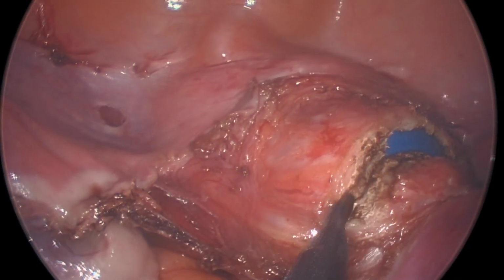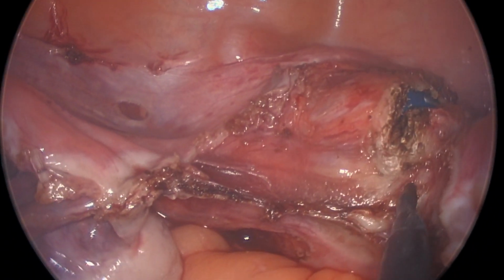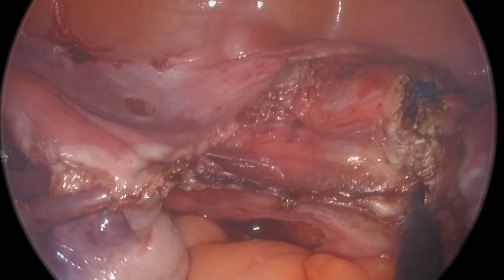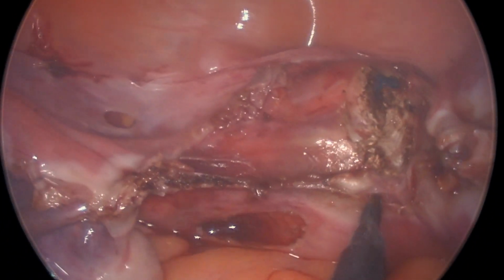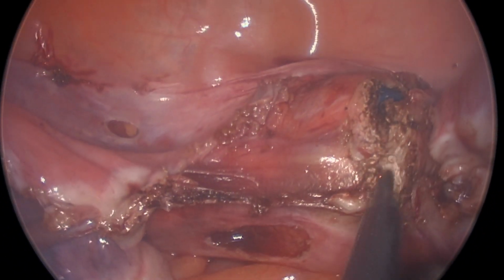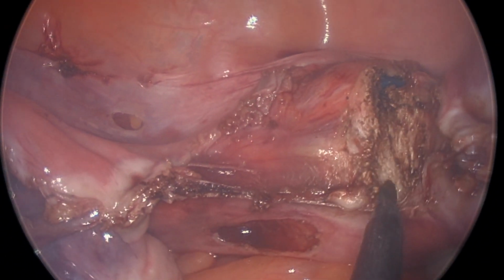In this hysterectomy video, the left lateral aspect of a colpotomy is being performed with a spatula. Coagulation current is used hovering just above the tissue. This results in a greater charge dispersion than what can be achieved with vaporization. On tension with the colpotomy cup, tissue is not only destroyed and coagulated, but also divided.